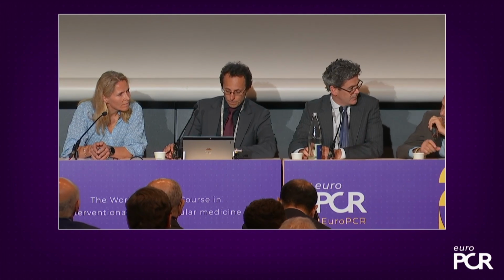Just one question to Anja. Which is your rate of imaging before PCI to assess the calcium burden and the length of calcium to choose the better tool? I think in these vessels, where you see moderate to severe calcium, you should do imaging in absolutely all of them to choose your correct device, and also to see the effect of what you've done.